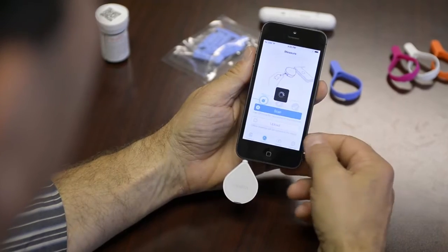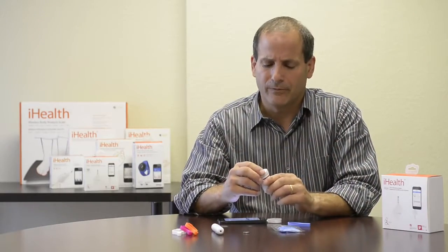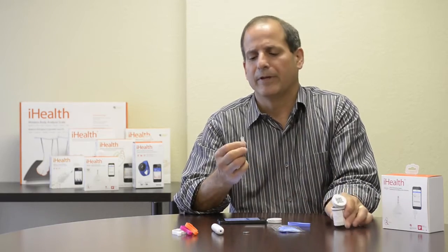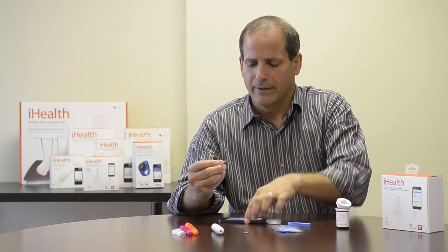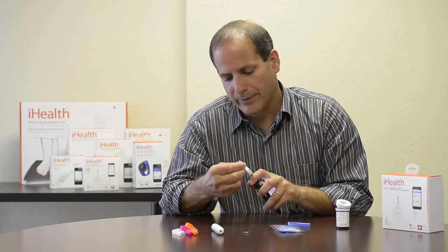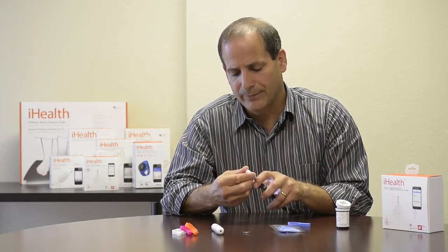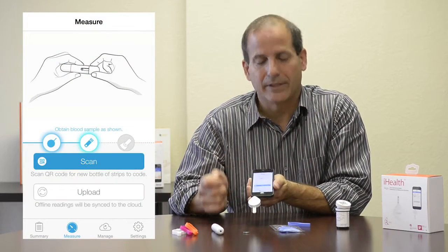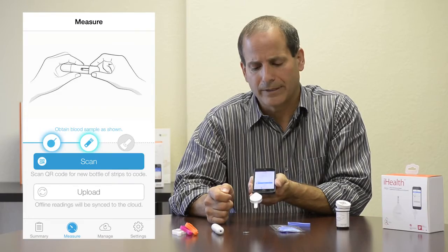Once the meter is ready and I've scanned the test strip vial, I extract one of the test strips, being careful not to touch the reading end, and I insert the strip into the little slot on the back of the meter, press it in firmly. I know it's inserted correctly because a little indicator light confirms the test strip is in place.